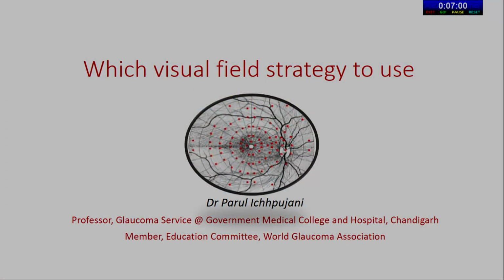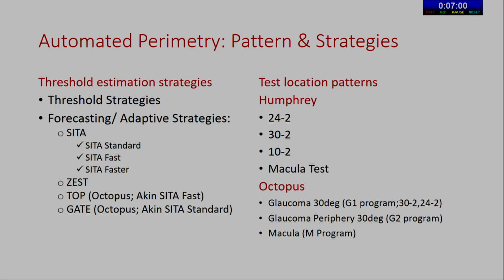to speak on which visual field strategy we should use. Good morning. I'll be talking about which visual field strategy to use. The visual field strategies and the test patterns on automated perimetry, they run in tandem.